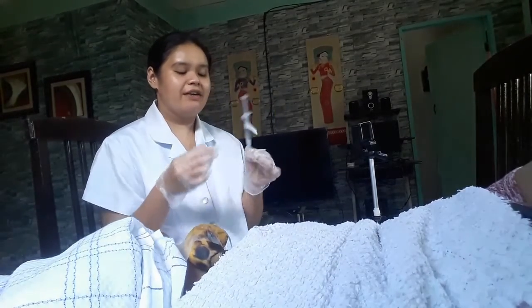After putting the gauze pad between my third and fourth finger, I will now get the syringe and remove the cap and hold it between my forefinger and thumb, holding it like I'm playing darts. And using the ulnar side of my hand just below the injection site, I put it here and then pull the skin about 1 or 1.5 inches and insert the needle.